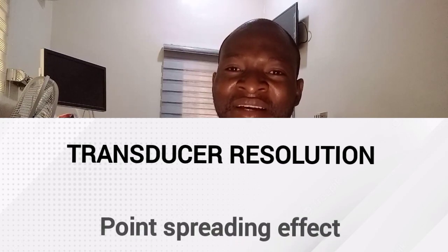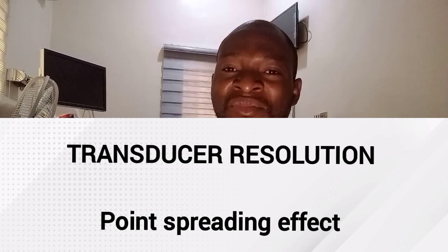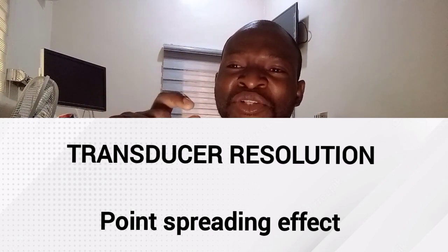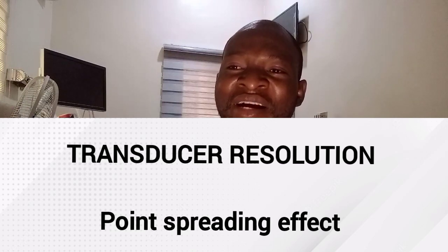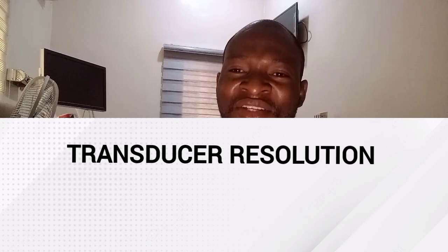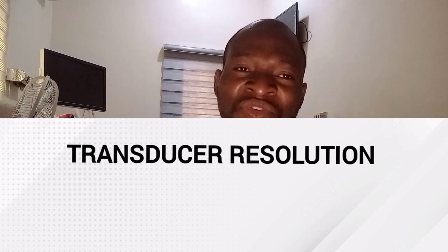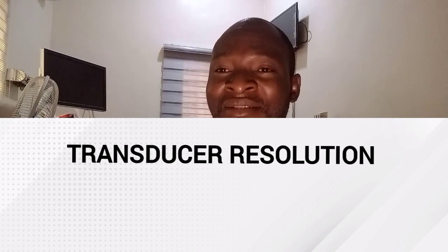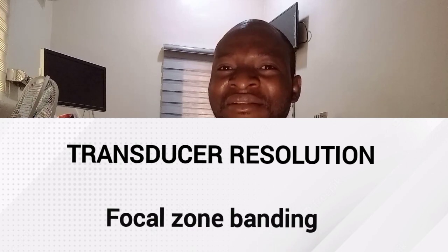Point spreading effect is another artifact that is caused by beam width. Point spreading causes a small point interface to be displayed as a short horizontal line. The wider the beam, the longer the line appears. The width of the echo is equal to the beam width at any given depth and shows the beam profile. Personally, I've seen that in low-end scanning machines.